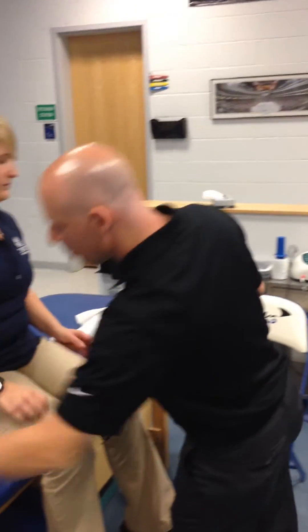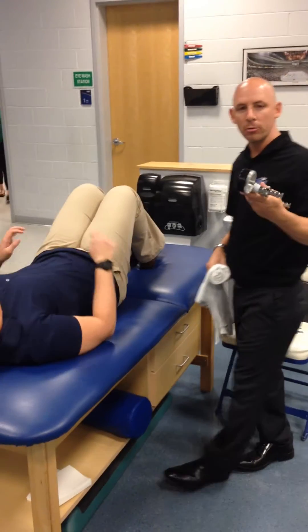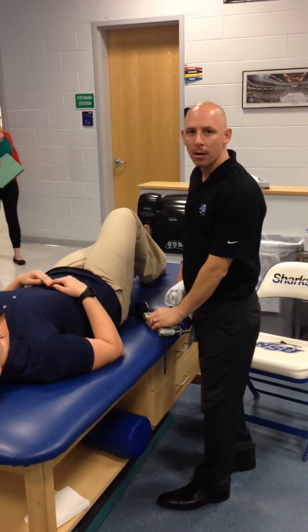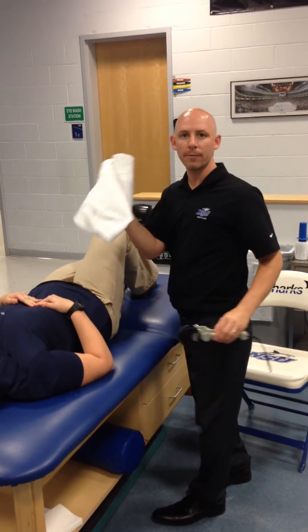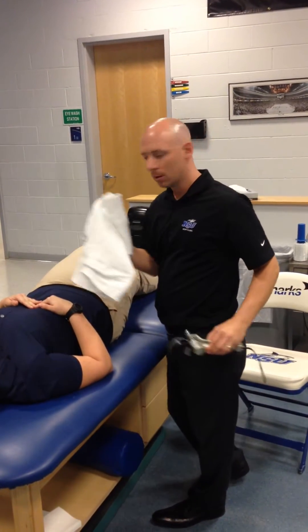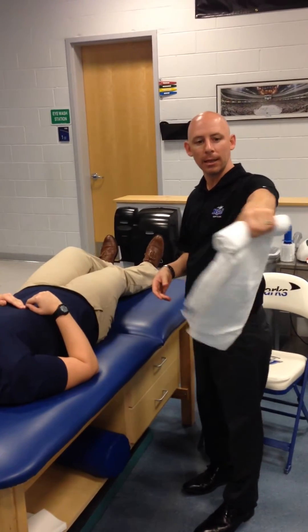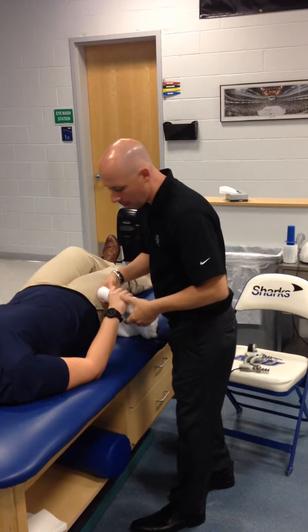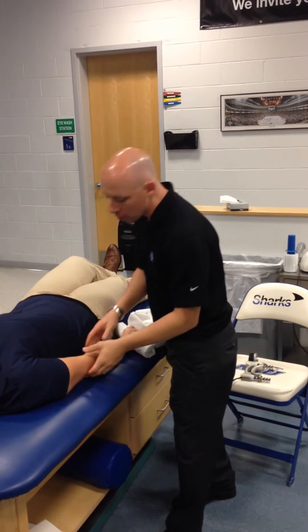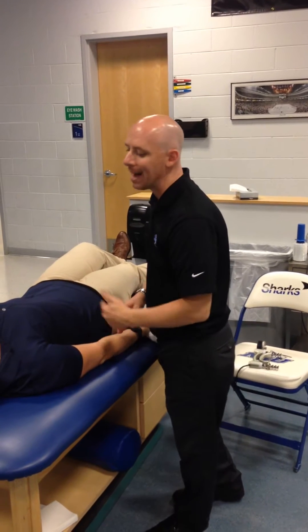What I'm going to do is lie her down on her back. I can use a dynamometer for her to grip here, but sometimes that's a little bit cumbersome for me. I have no problems if you just use a rolled towel — just roll it up so they can get a good grip of it. Then what I have her do is put her elbow back straight. Just to make sure that I have a good baseline, I'm going to ask her one more time: squeeze as hard as you can.